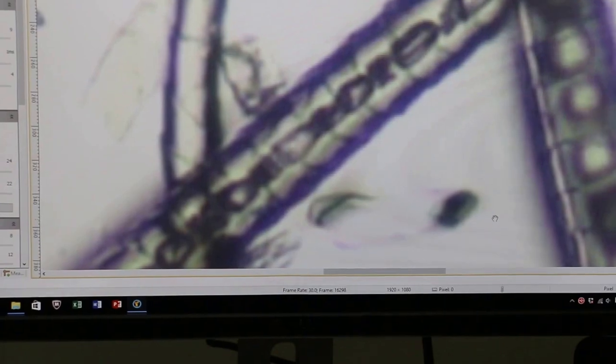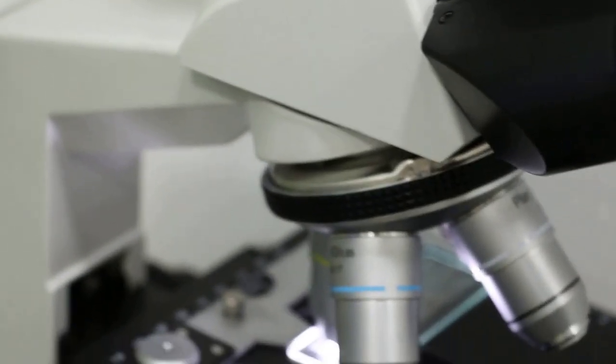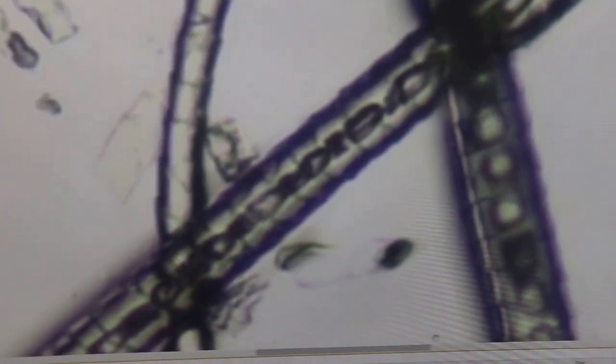And those rashes, those spots are due to bacterial infection and due to traumatic injury. Maybe the dog is using the back paw to scratch the area to relieve the itch, although the owner says she has not seen it being done. From microscopic examination we have this monitor to show the customer that definitely there is no outpouching and therefore no spores or hyphae on the cuticle. So in conclusion this Pomeranian has no ringworm in those hairs we collected over the hot spot.